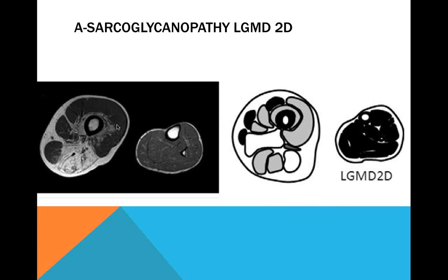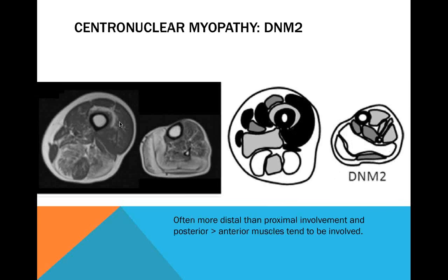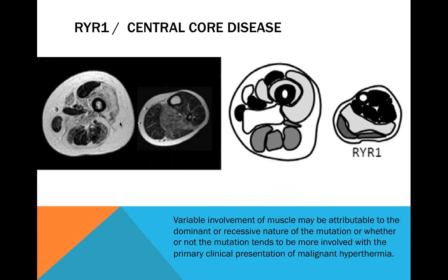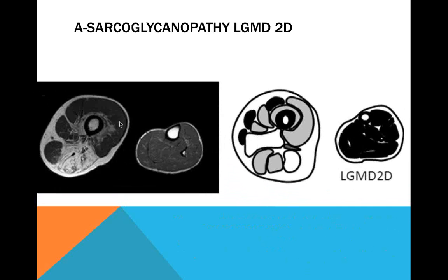And the same is the case for this region, vastus lateralis. They all kind of get atrophic and smaller than the other diseases, whereas in the sarcoglycanopathies and other muscular dystrophies, they tend to get a lot bigger and kind of swollen in appearance. And I wonder if that's something related to the inflammation component of it.